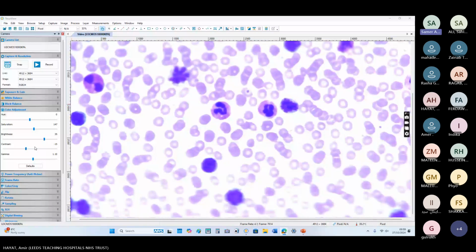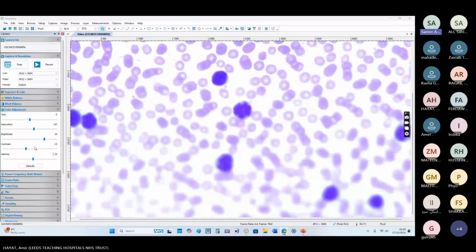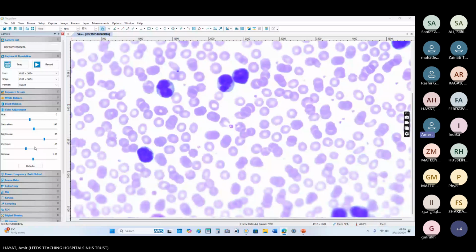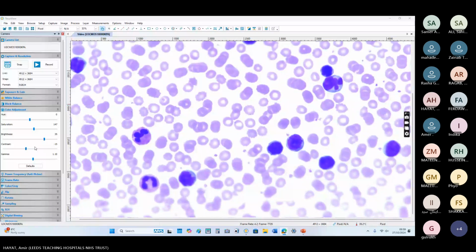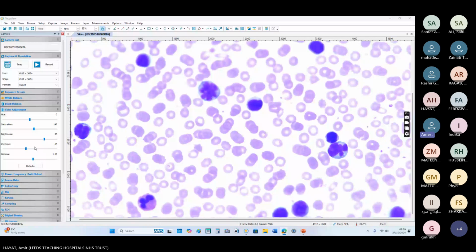Yeah. And how can you describe this cell that you just passed through? It has some blebbing, and some of these have a flowering sort of outline. Like that. Yeah. Like this one. That one. Yeah. So what do you think? This is acute leukemia, this is CLL, this is ALL, or this is ATLL.